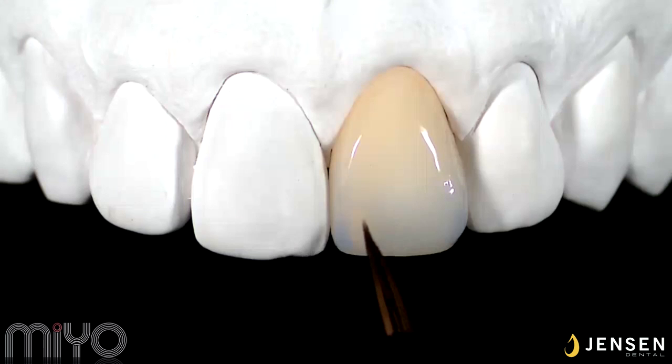Now here's mamelon coral. As you apply the mamelons, the layered look starts to really form. Starting off with mesial and the distal lobes, the mamelon structure on the mesial and the distal lobes usually looks similar to a reverse cone, and it's usually smooth in transition. The middle zone though is a bit more of an irregular shape with same direction of the tooth.